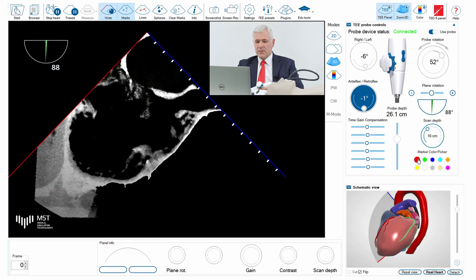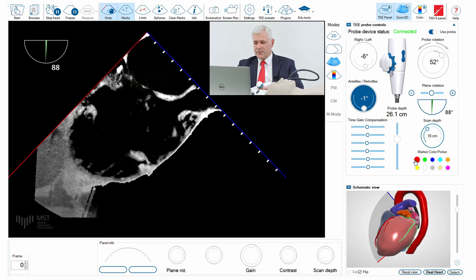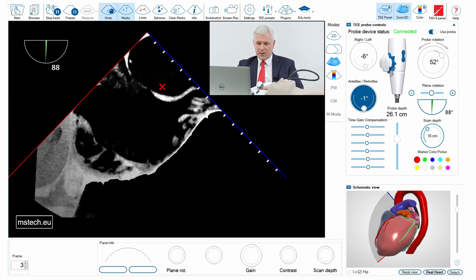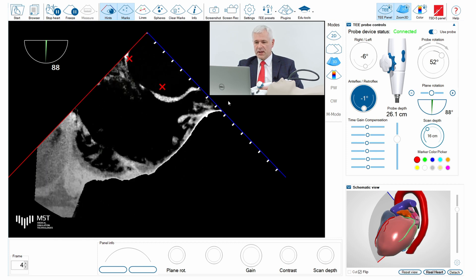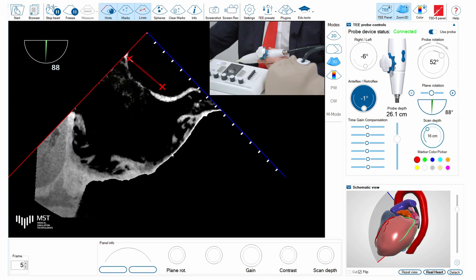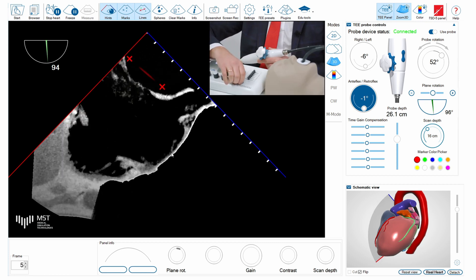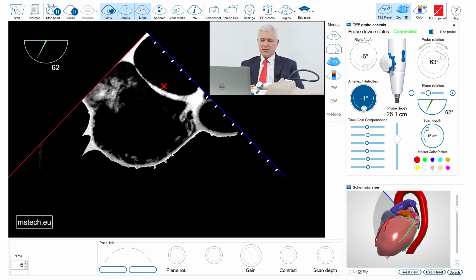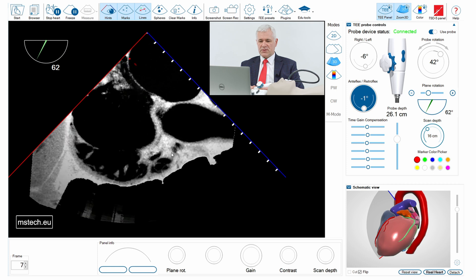What we really need is the true anatomy, which this model provides. In the bicaval view, we can check how far we are from each of the vena cavae. I will put markers on the upper and lower vena cava locations and connect those markers with a line. Then I will turn my plane to 60 degrees to see the short axis view.